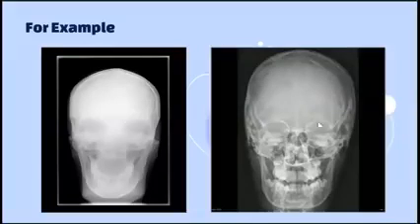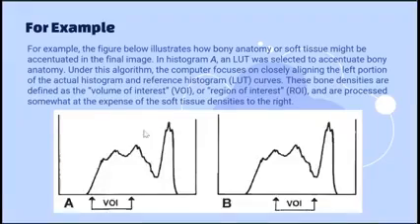Focused. Okay, the bony anatomy is more focused here, although there is a loss of spatial resolution because I zoomed the image. Never mind the spatial resolution, we will just focus on the bony structures. As you can see here, the bones are very clear if your histogram is like this.